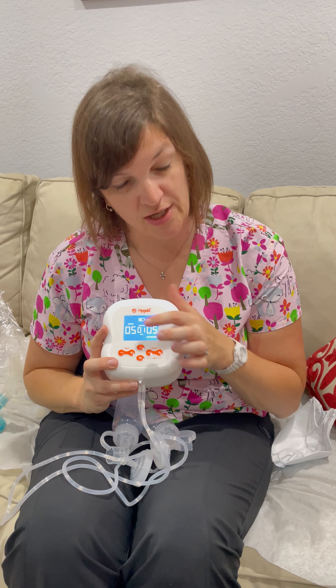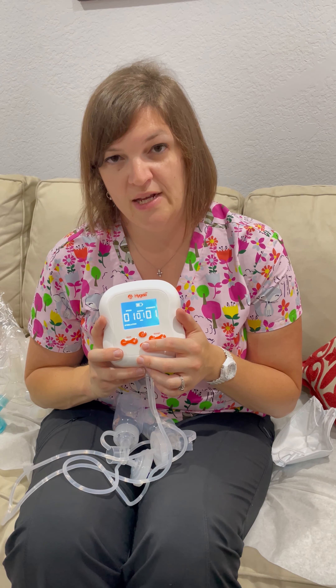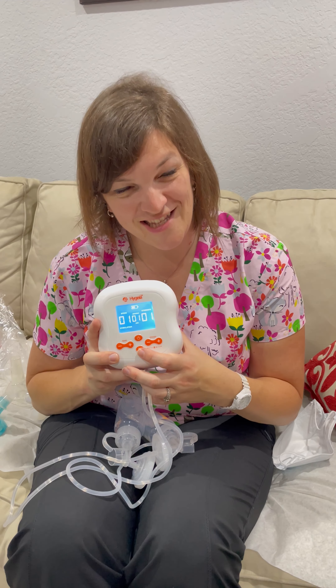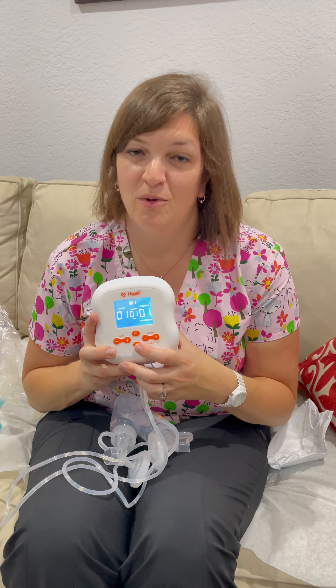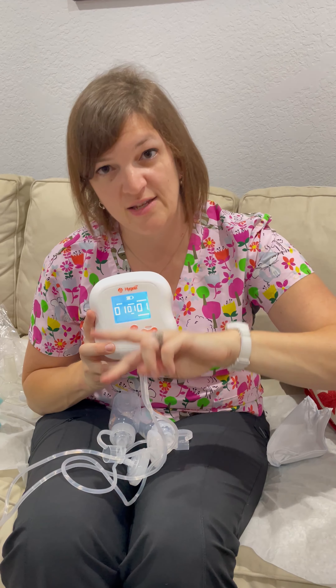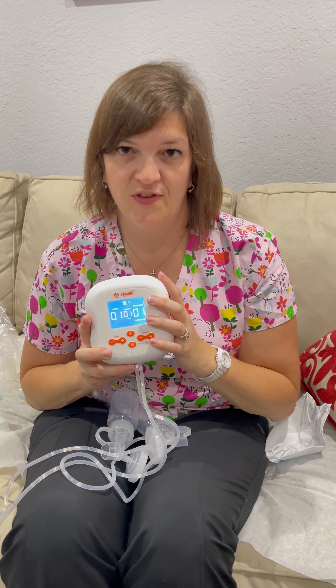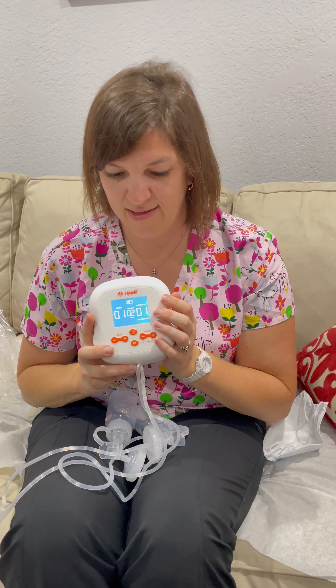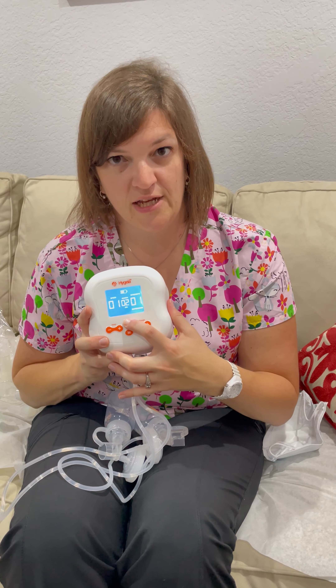You're going to start on the stimulation mode and pump for one to two minutes until you start to see your milk move. Then switch it to the expression mode and express for four to six minutes. Then go back to the stimulation mode and stimulate for one to two minutes, then back to expression mode for four to six minutes. So you're going to go back and forth between stimulate, express, stimulate, express several times during your 15 to 20 minute pump session. That's going to trigger your body to let down more milk and then move that milk — stimulate your body to let down more milk and move that milk, just like your baby would at the breast. And when you're done, you're going to hit that power button again.